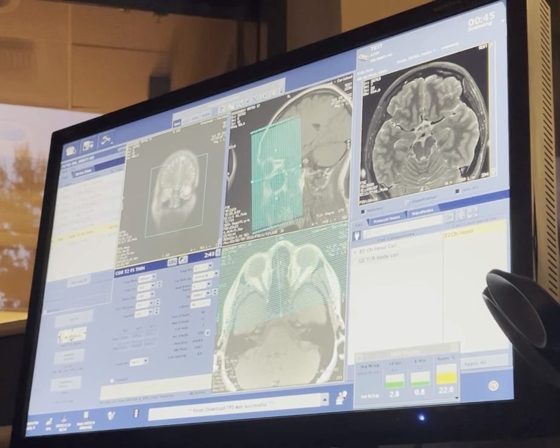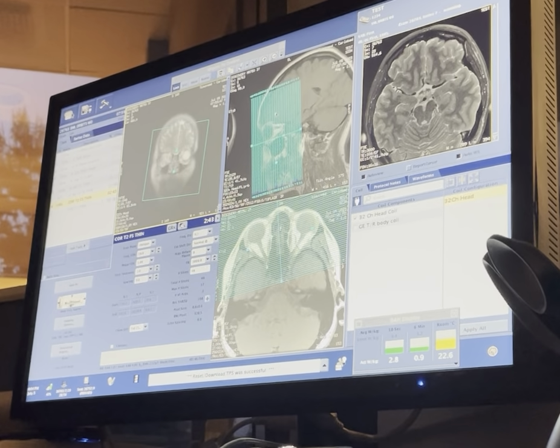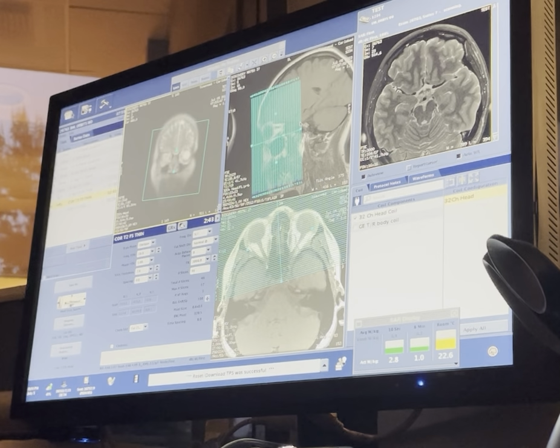Now you're gonna rotate so that the eyeballs, the globes, are kind of level. Perfect. Now, what I'm gonna have you do is go on this plane. Now we're gonna go in the sagittal plane, and we're gonna look from the side, and we're gonna use these slices. That's how they're appearing right now. Angle this middle bar with that. You could probably put that middle bar right on it. Why don't you just put it right on it? Yep, and now angle it.